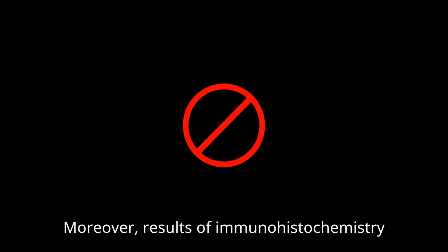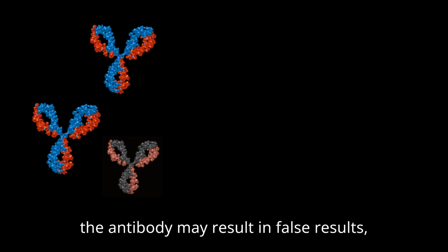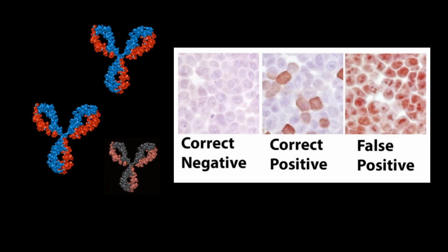Moreover, results of immunohistochemistry are not always accurate. Problems with the antibody may result in false results, such as false negatives or positives.